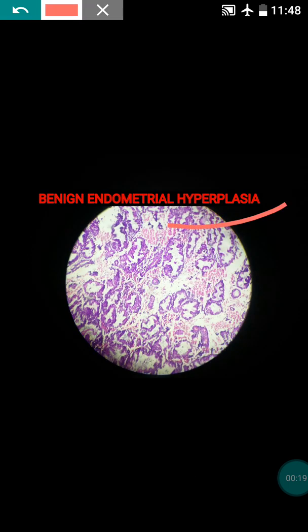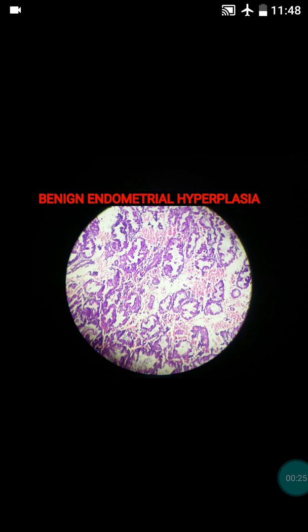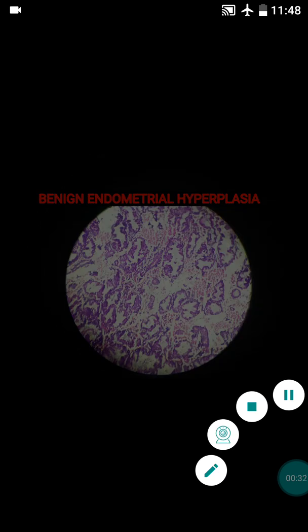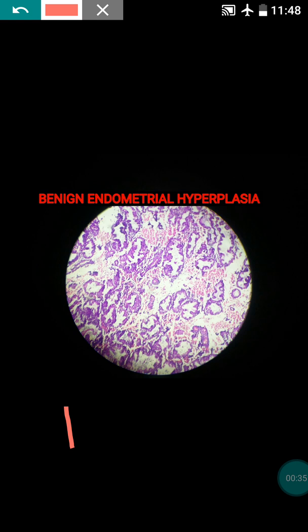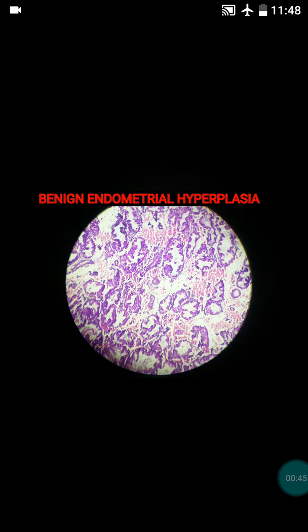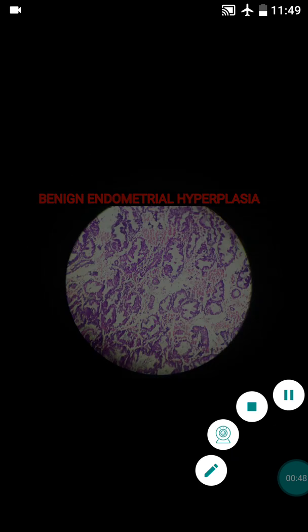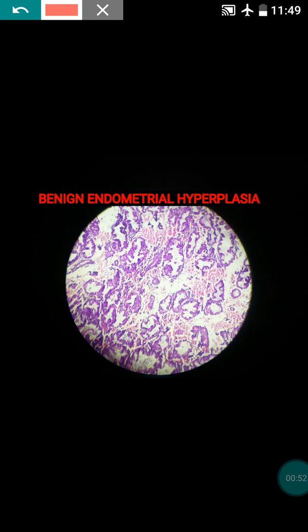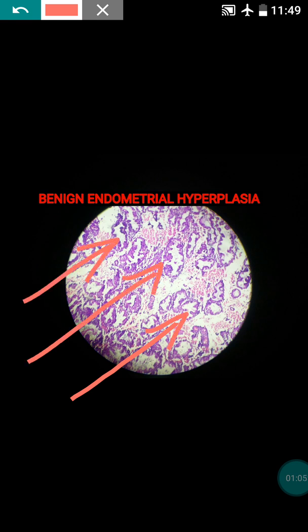Hyperplasia means an increased number of cells. Endometrial hyperplasia includes proliferation of the endometrial glands. Normally, the gland to stroma ratio is 1:1, as the endometrium is made up of glands and stroma. Hyperplasia is defined when there is an increased number of glands compared to stroma — more than 1:1 — meaning endometrial glands will be more than 50% of the stroma.